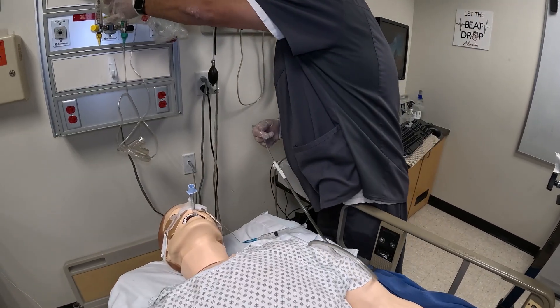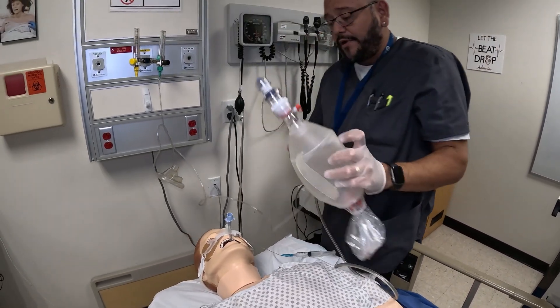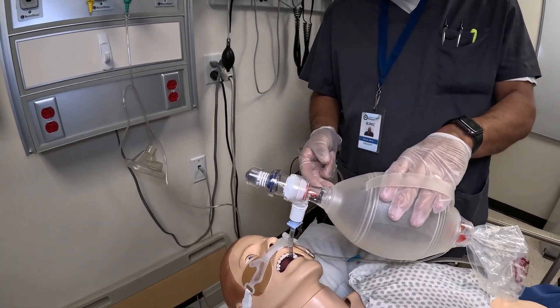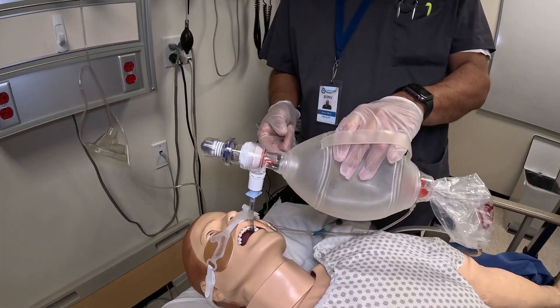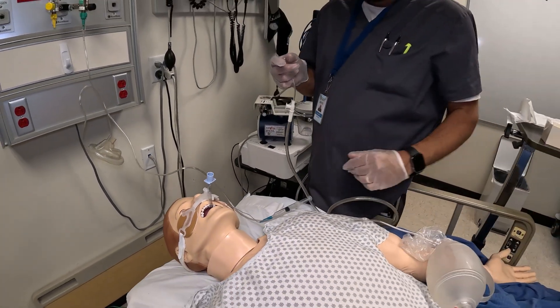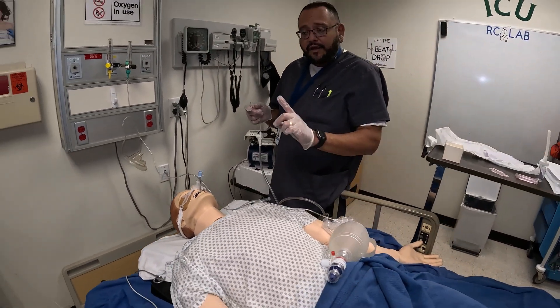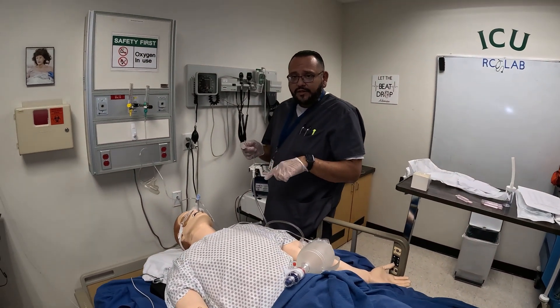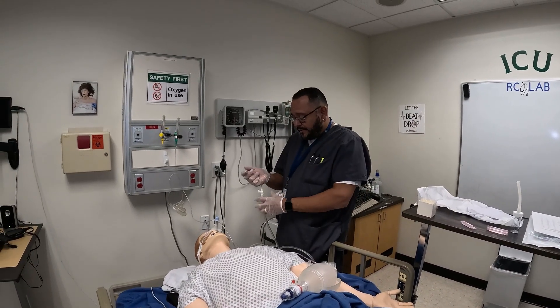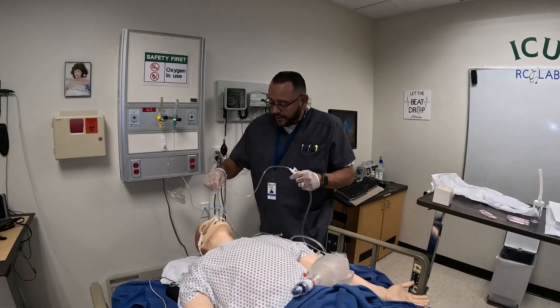The patient would be on a ventilator or we would use our ambu bag to hyper-oxygenate the patient before suctioning. I would go ahead and get them up to 100% on the monitor. On the ventilator there is typically a button you can push that gives the patient 100% oxygen for two minutes and also silences the alarms.